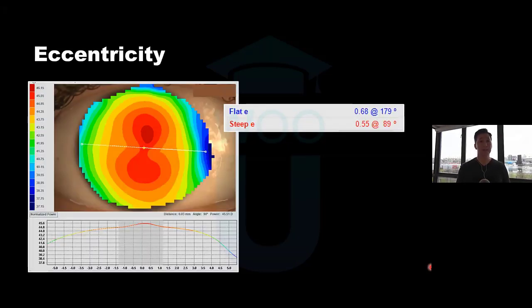Another thing that you might look at is the eccentricity of the eye. It's been shown that the higher the E value, the better the cornea responds to ortho-K. The flatter the cornea, the less well it responds to ortho-K. So thinking similarly to radius, steeper corneas respond very well. Higher eccentricity eyes respond very well. So your worst patient is your flat, low eccentricity eye with a higher Rx. Now, would you be worried about fitting a patient that's a 39 diopter radius and a 0.3 eccentricity with a -1 refraction? No, you wouldn't, but a -6, that's a pretty tough go. So you're warned up front. What is an easy patient? What is a difficult patient?